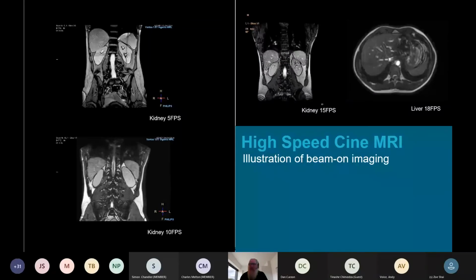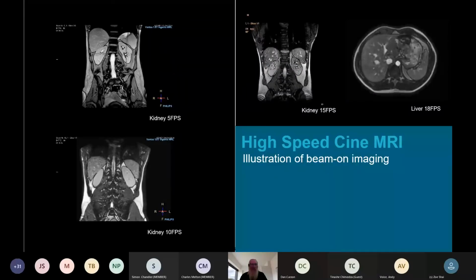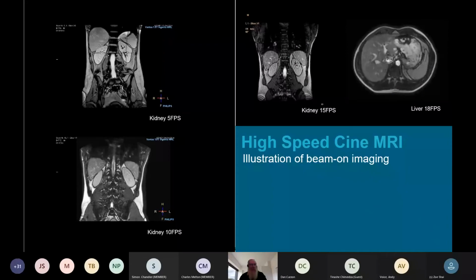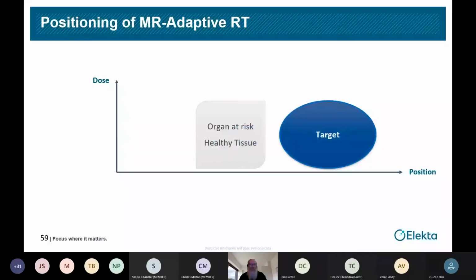So we don't have the dose distribution as that beautiful distribution from the protons, but we can see what we're shooting at, and that's really important in these soft tissue tumors in the body. This is a little complicated to understand, but imagine this is the target we're trying to shoot the radiation at, and right next to it you've got something we really don't want to give any radiation to, like the spinal cord, for example.